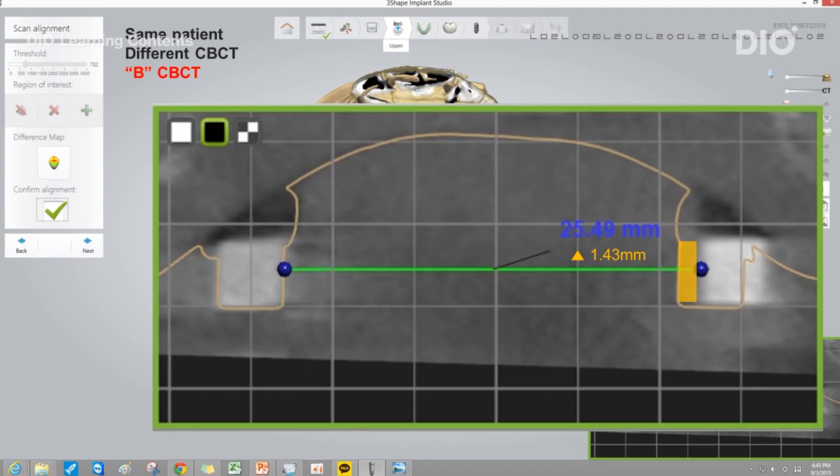What would happen if this problem occurred while making a surgical guide for the patient? The most uncomfortable thing is that you have to call in the patient again to retake the CT. No one would want this situation.